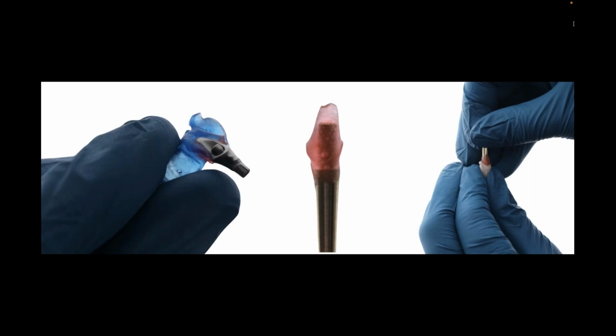And normally when we do these kinds of implant cases, by the way, we provide some information. Kian does a lot of work with this. So we actually make an implant jig, and that's made on the cast. So the doctor can actually take the abutment off the cast with the jig and place it into the mouth, and that verifies a lot of the fit and the information. We also make what we call a little cement plunger. So that little Darley jig you see there is basically just a plunger to put in and out of the crown.